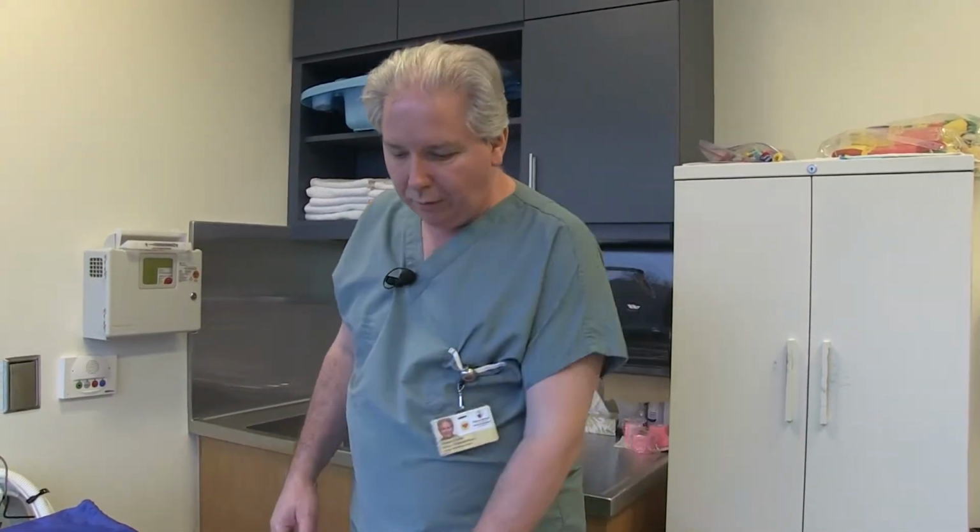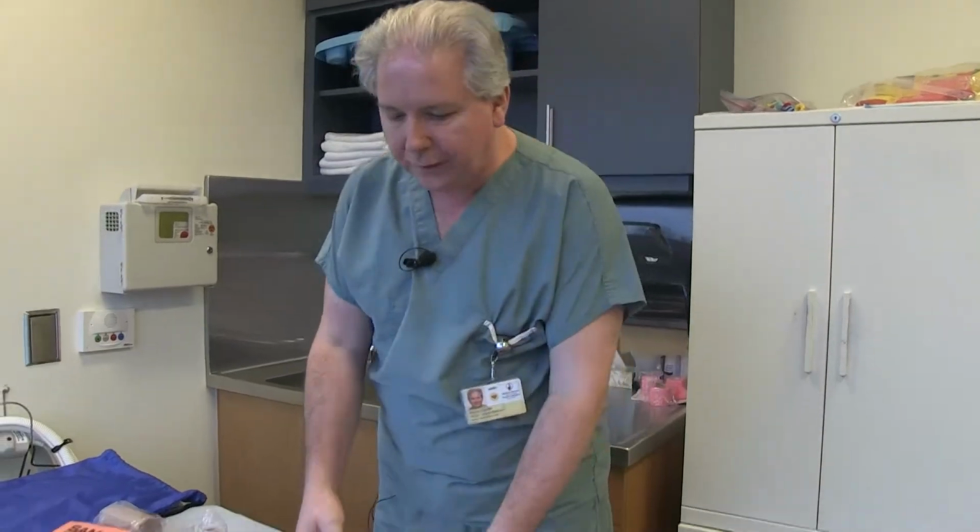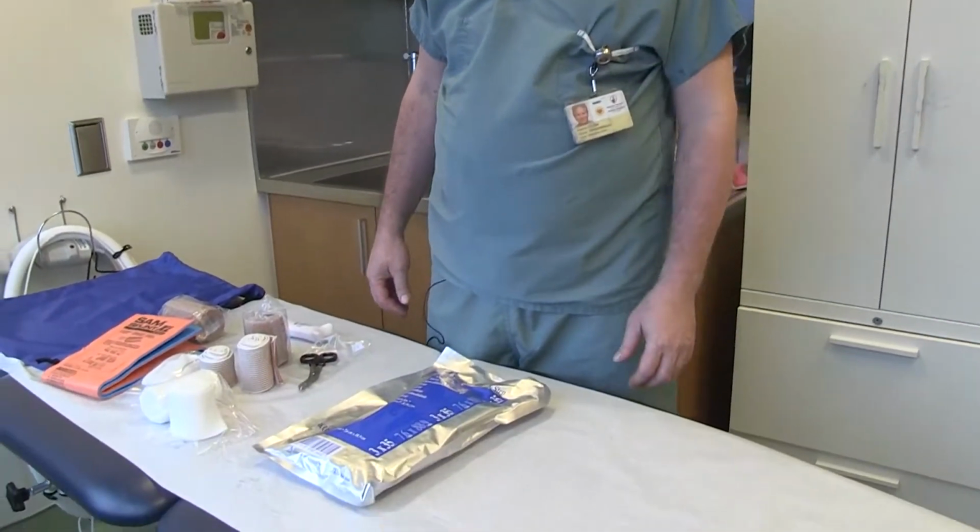My name is Pierre Ouellet. I'm a nurse and orthopedic technician at the Shriners Hospitals for Children, Canada. Today we will demonstrate how to use a fiberglass brace to temporarily immobilize a fracture. Dominique will be my patient today.